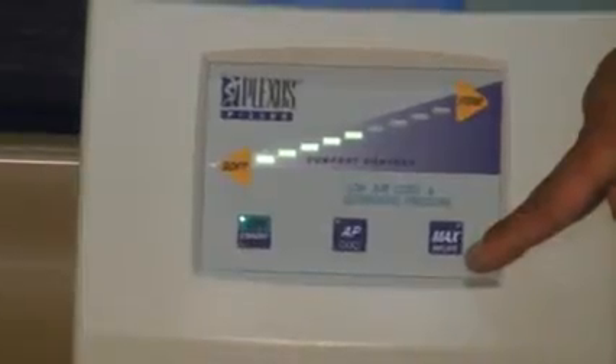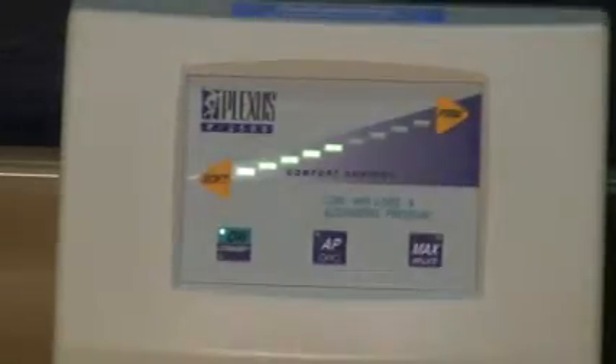Max inflate is used for initial rapid inflation of your air mattress. Nurses and caregivers may also use max inflate for easy patient positioning — to help the patient get in and out of bed and to help treat the patient's wounds for patient care. Max inflate has a 30-minute time limit; after 30 minutes, if activated, it will automatically shut itself off and return to the normal comfort control setting selected by the therapist.